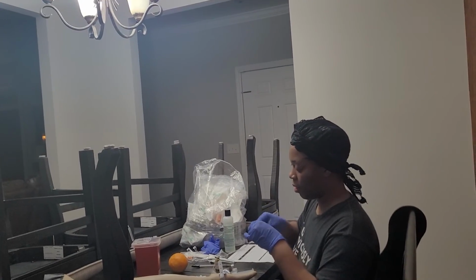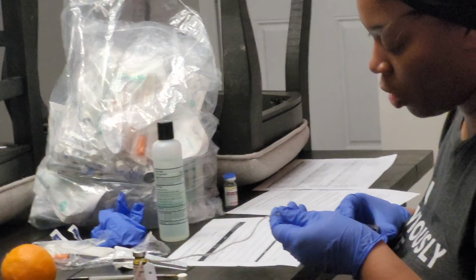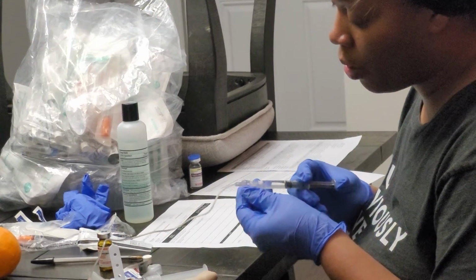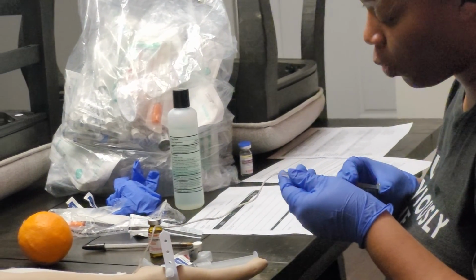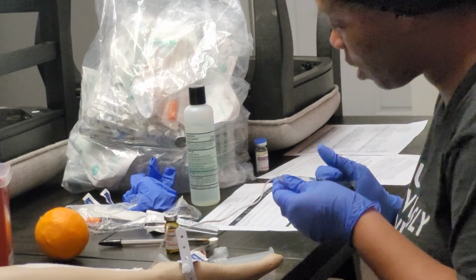Connect my syringe. And I am administering 2 mLs, which is 20 milligrams, over 2 minutes.